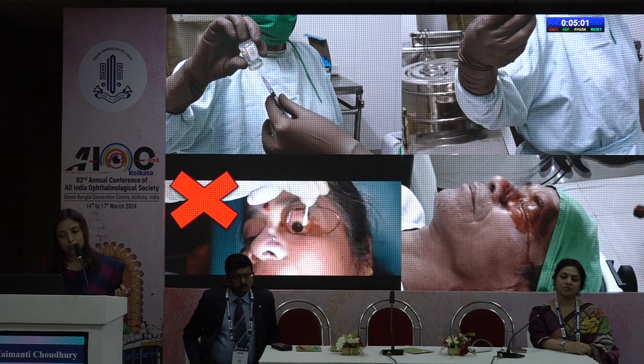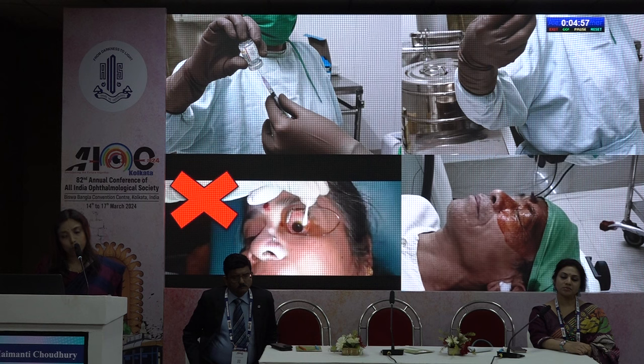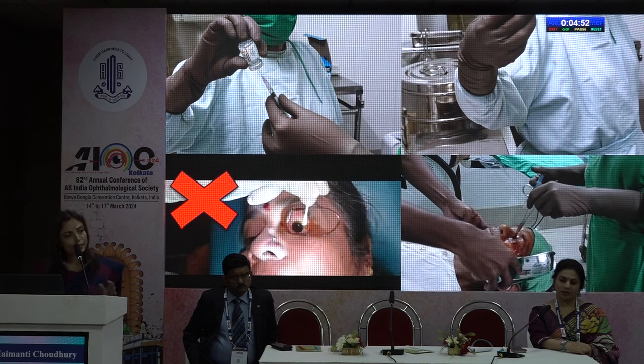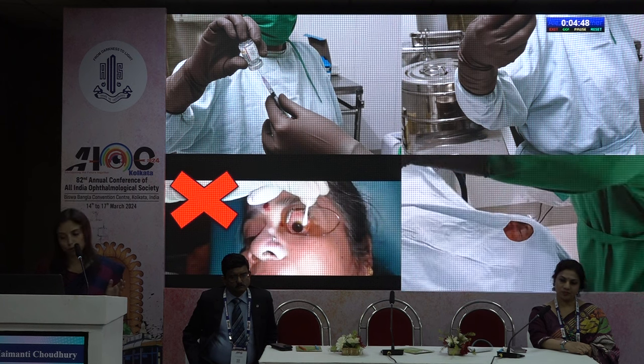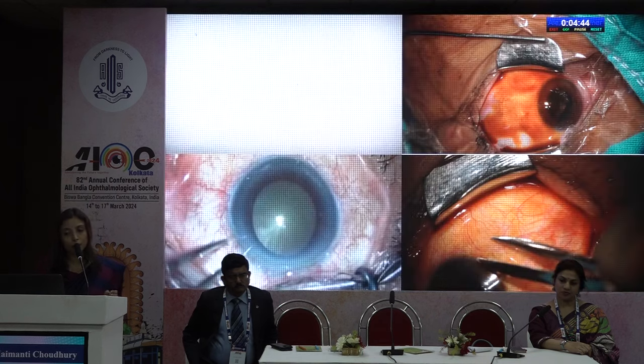In contrast, this is the fourth video, which is running now, where we are preparing the patient with 10% betadine. That we would do for any other intraocular surgery. We have to treat injections like any other intraocular surgery. Draping and polythene draping, all has to be done.